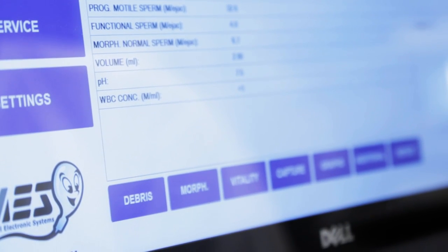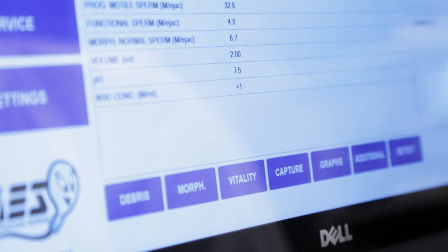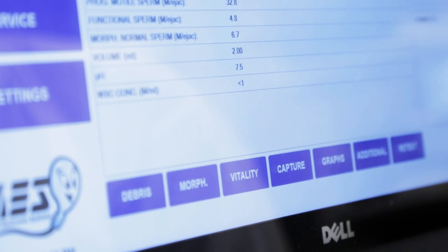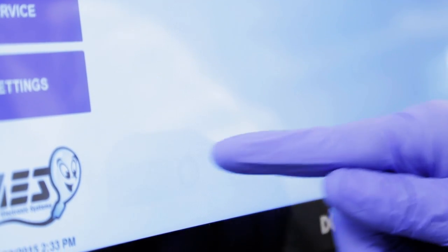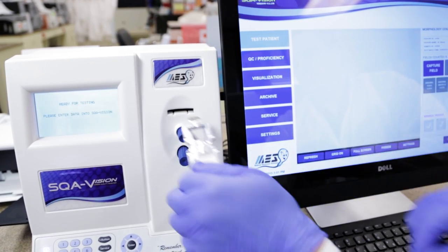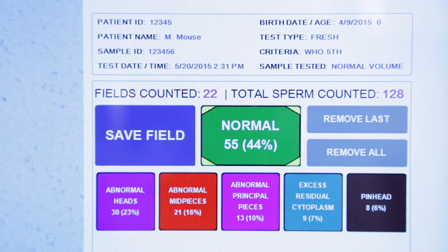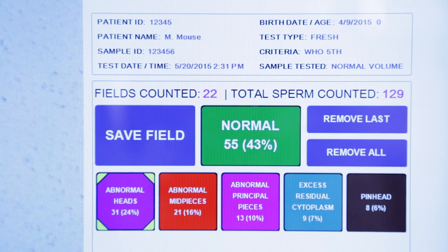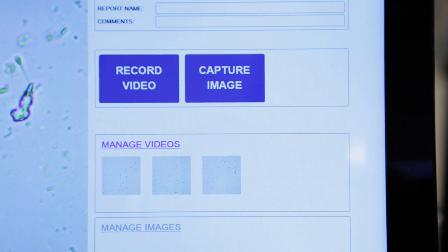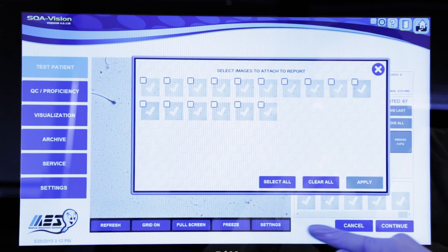The Vision now offers you the dynamic ability to use our touch-to-mark technology to run full differential morphology, vitality, sample visualization, and more. To access the click-to-mark counters, simply touch the relevant button, load your slide, and insert it into the system. Then capture a field and circle the relevant sperm cells based on the parameters you defined. The Vision will tally your results, save them as images or videos, and attach them to the test report for future assessment.